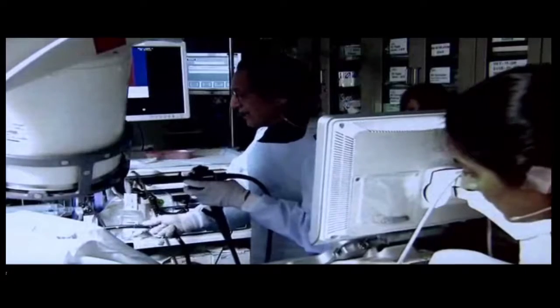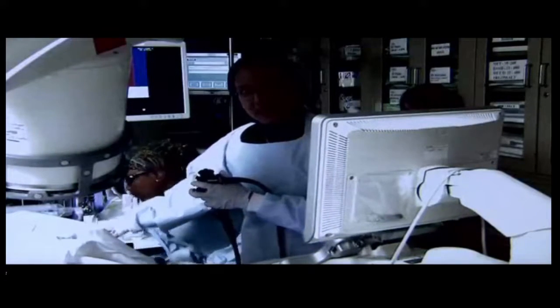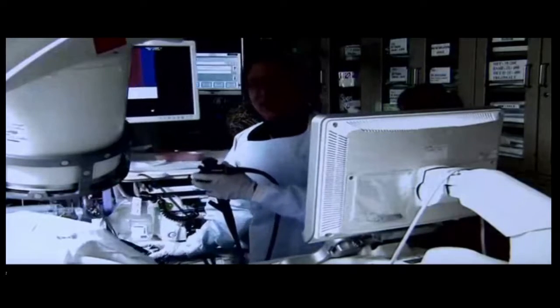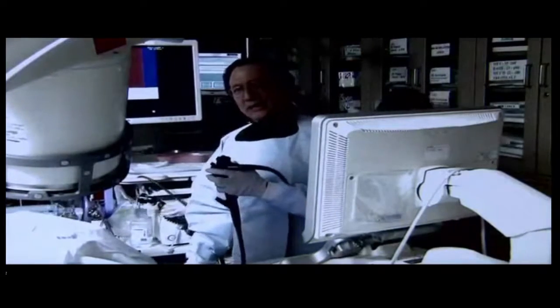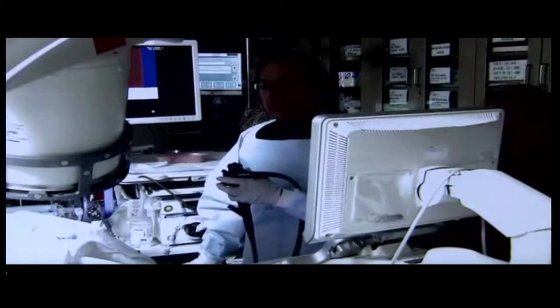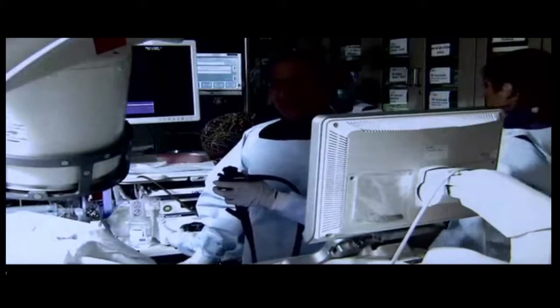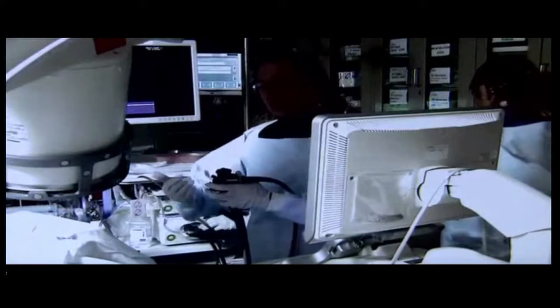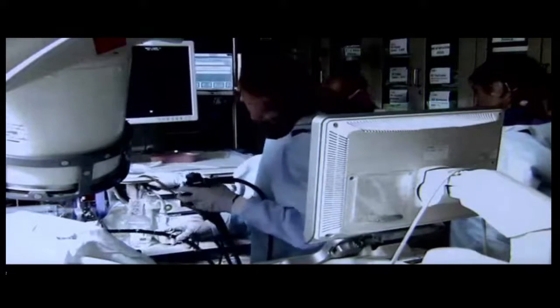At any rate, we were able to get the Pathfinder wire to cross the Santorini, the minor papilla, and then we completed the rendezvous. So the quick answer is no, and a non-dilated duct by no means excludes an obstruction of the duct. Of course, we sort of think of the duct as dilating up if it's obstructed, but this duct was not dilated, but clearly she had no drainage from the minor papilla.